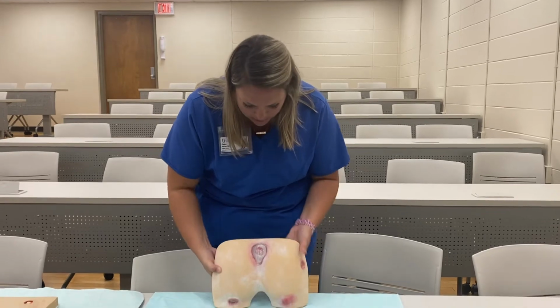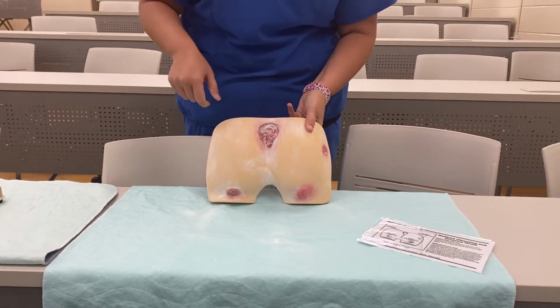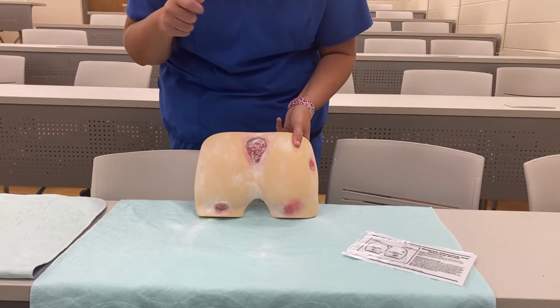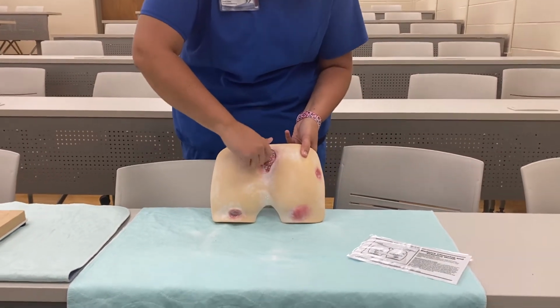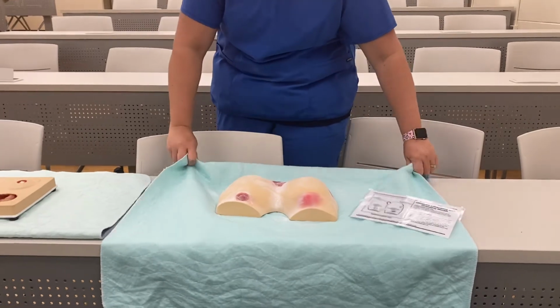And what's really cool about this one is you can really see the tunneling. Okay, when we're doing dressing changes this week, you might have some tunneling, and we've got to take our cotton tip applicator and really get the gauze underneath all of that tunneling in the wound. So that's why these are really great to look at.